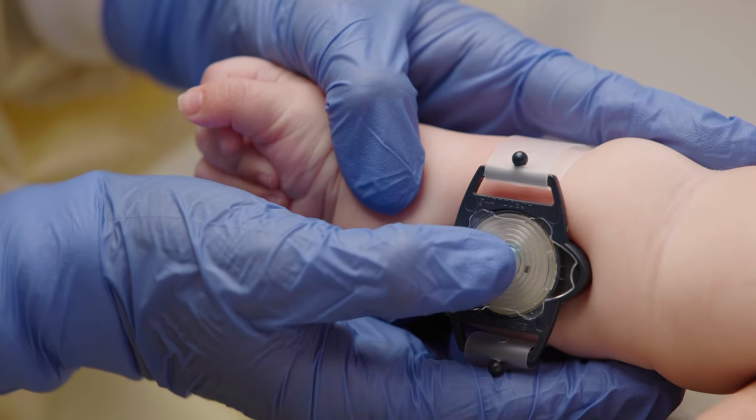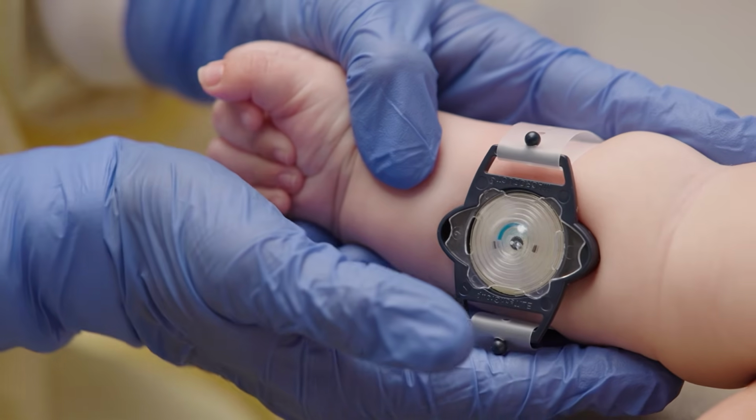Check that the collector is tight enough by pressing the collector firmly against the skin. If sweat in the tubing moves by more than 2 to 3 millimeters, attach the strap more firmly. The collector should not be placed too tightly, as that may block sweat from entering the coil.